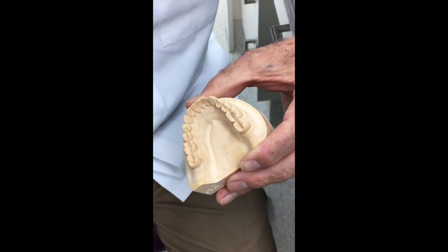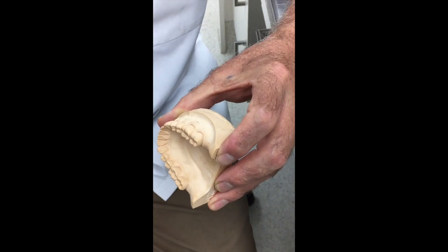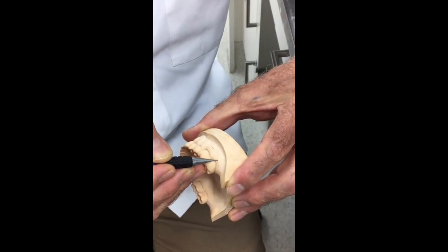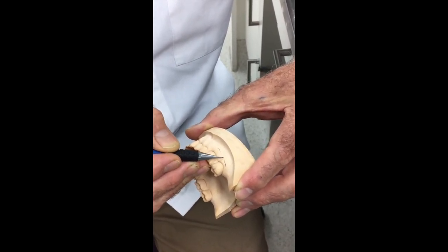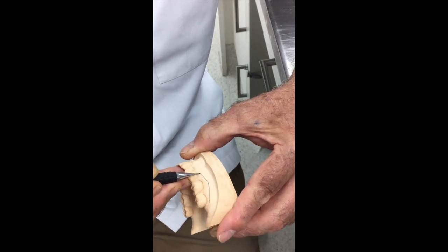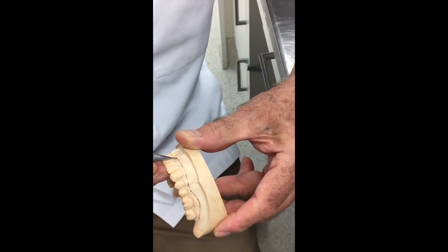Because remember that we don't want this patient to go through multiple impression takings if we can avoid that, because it's uncomfortable for a patient at the end of a long procedure. So we then go to one tooth either side, the abutment tooth either side, and about halfway is where the periphery of the tray is going to come up to being about 1.5 millimetres over the gingiva. So we're just sweeping that down to the 4 millimetre position, and then we have the abutment tooth here, and it's just gradually sweeping up to be about 1.5 to 2 millimetres below the gingiva, and then we progress that around the whole of the arch at that distance below the gingiva.